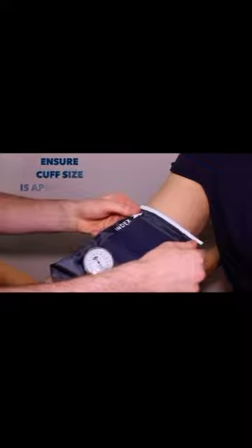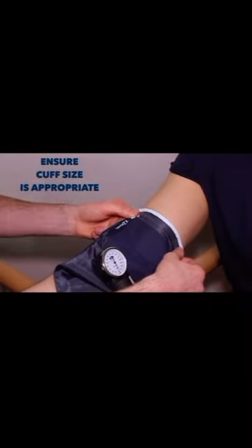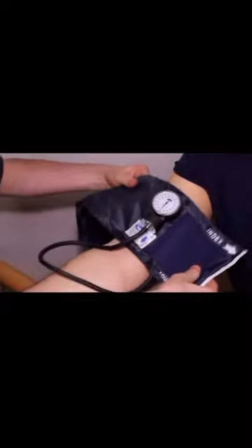Taking a manual blood pressure. After gaining consent, get the patient to place their arm in a rested position near the level of the heart. Ensure cuff size is appropriate, where it should be wide enough to cover 40 to 80% of the distance from the elbow to the patient's shoulder.